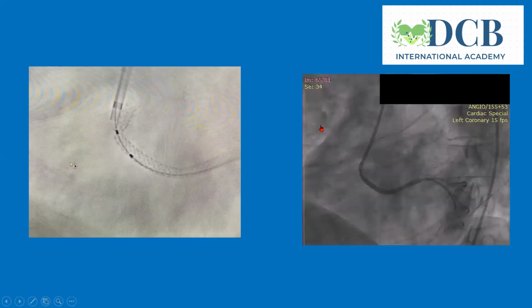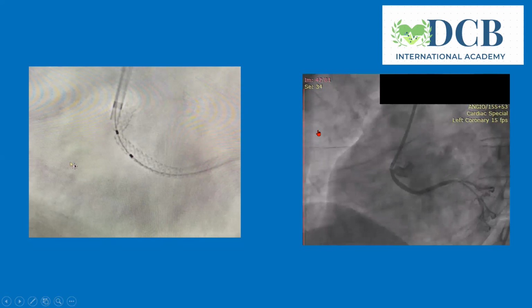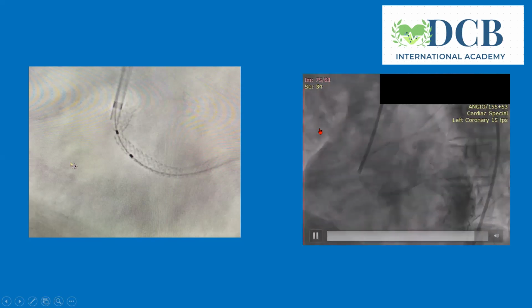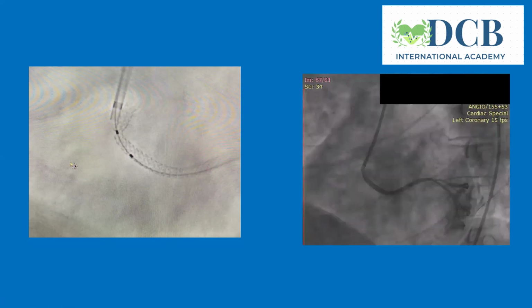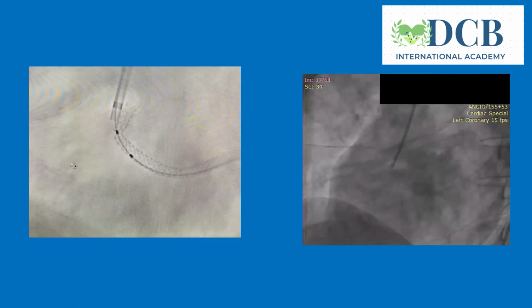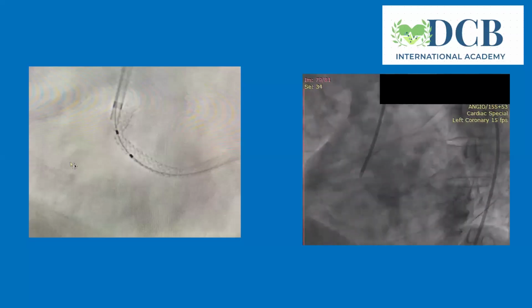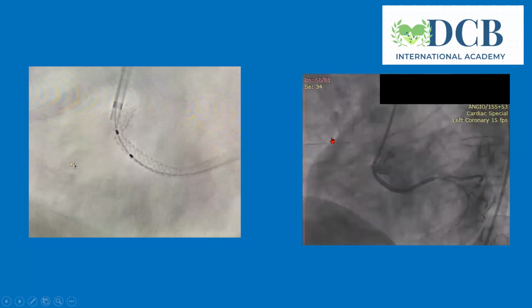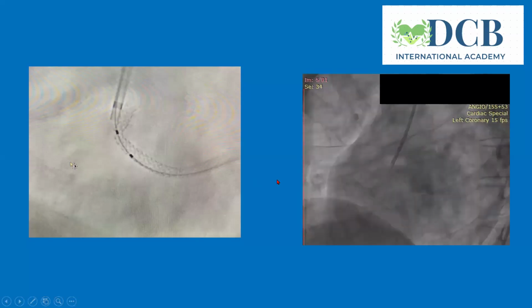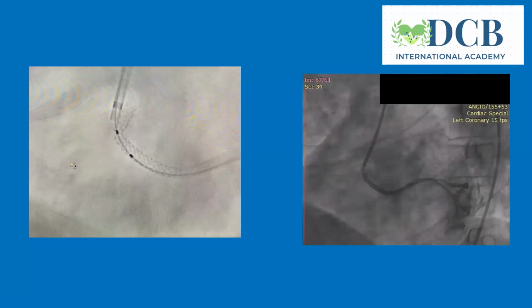Unfortunately, we don't have those angled microcatheters in India, where I was working in this hospital. Also we had taken femoral access, because initially we did the diagnostic angiogram through radial access, and then this was femoral access. We tried to wire this multiple times. Actually, we couldn't. So the idea of crushing was not safe and ideal. So as suggested by the professor, we didn't crush this.